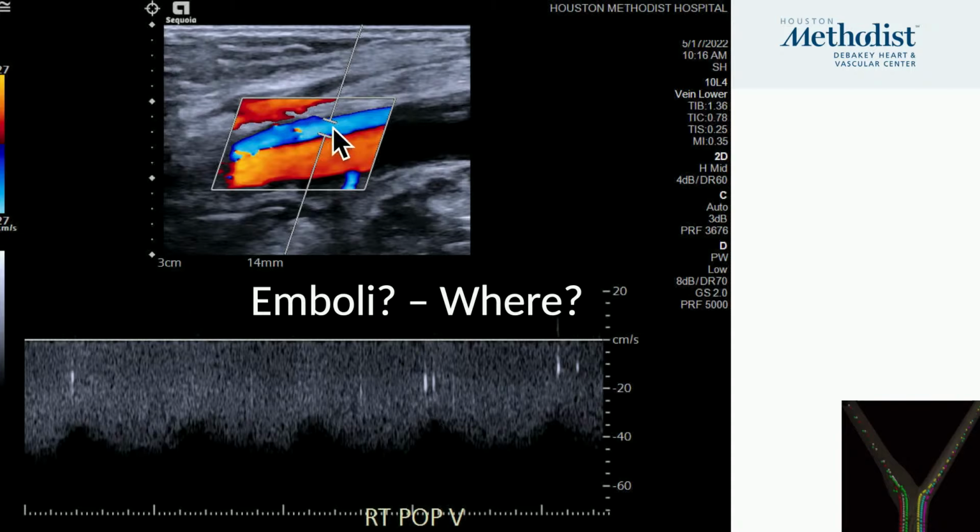And what you see in the popliteal vein, there's an embolus 1, 2, 3, 4, 5, and maybe more in the background. And I don't think we really pay attention when we see that, and unfortunately our duplex machines are really not recording the sound. So I cannot really play you back, in the background, do you hear anything, because for the embolus detection we really need to hear a distinct sound of that microembolus signal.